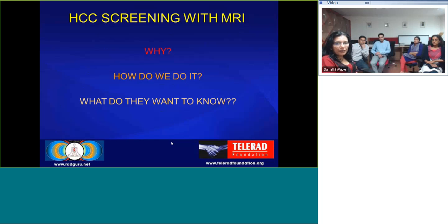So anything that we look at, I try to approach it like, why are we doing this? Should we even do this test? And how do we do it? Because the technique, especially in MRI, as you all know, is extremely important, more so than CT, which has more standardized protocols. And what is it that they, meaning clinicians, want to know from us?